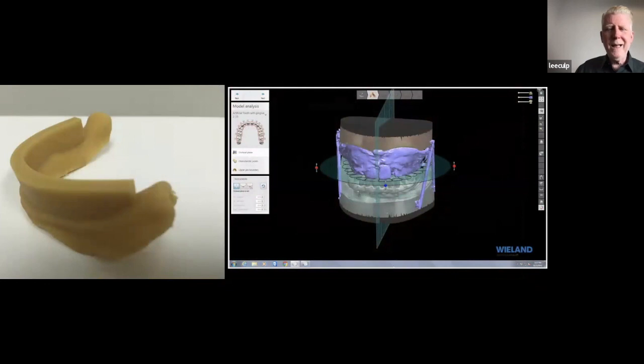And then we just started playing with the software. So we figured out how to trick the software into making bite blocks. We would actually design two copings. We would take the tissue, we would design just one big coping that went everywhere on the tissue that we wanted it. And then we applied a bar on top of it. So before, we figured out how to do bite blocks, and then we're printing those out. Right in the beginning, this was some of the newer, smaller printers we've been printing for many, many years.